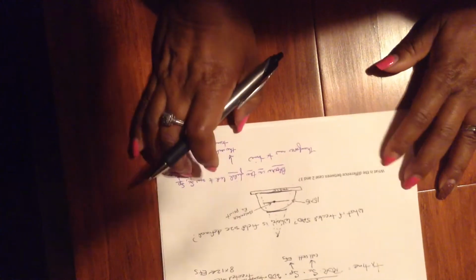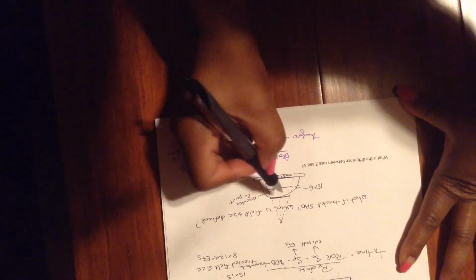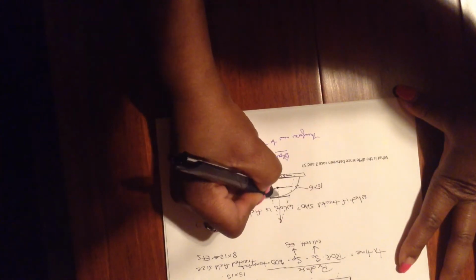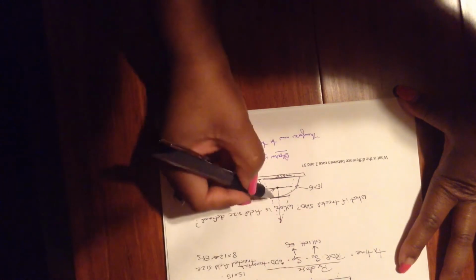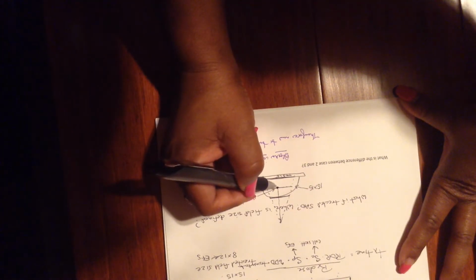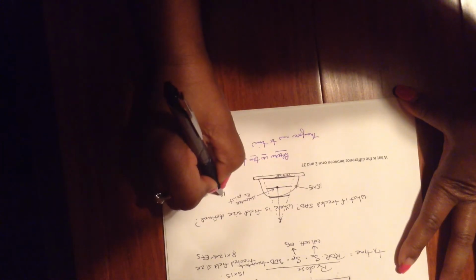So in case you get a question that asks what the field size might be at a point away from isocenter, you could use a direct proportion. Isocenter is 80 cm from the source. In both situations, isocenter is constant. For cobalt, it's 80 cm from the source. For the linear accelerator, it's 100 cm from the source. So the field size is 15. I'm just going to take one dimension.